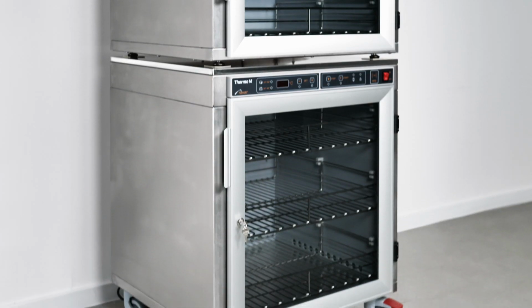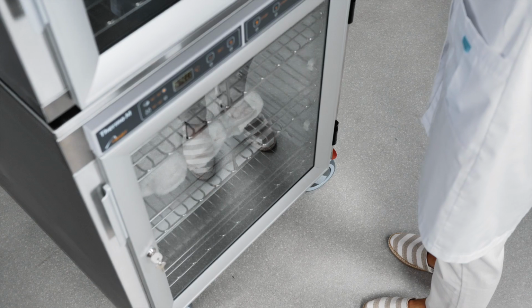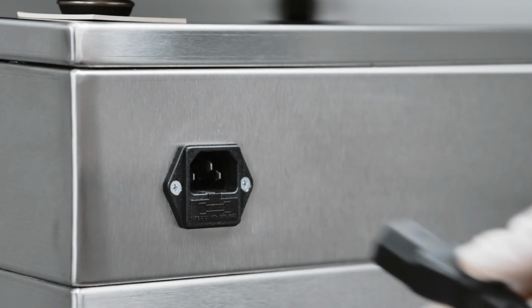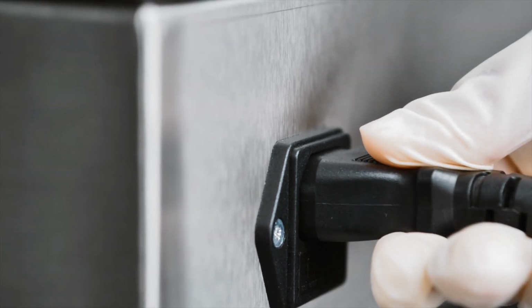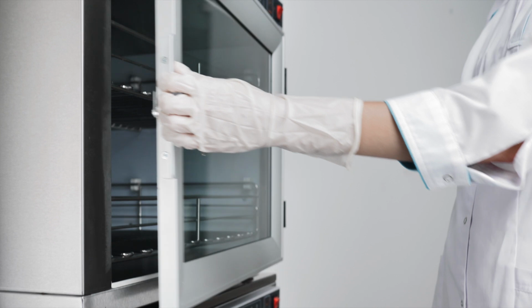Install the warming cabinet, ensuring that the door opens freely. Step on the wheel brakes if using the mobile version. Connect the power cable. Plug it in the power socket. Open the door.